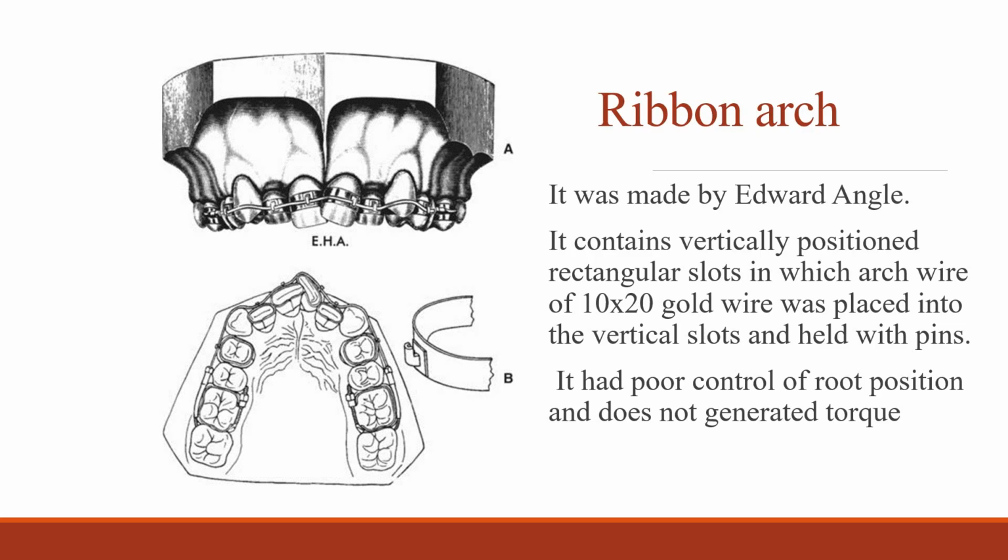The standard edgewise appliance originated from the work of Edward Angle. Everyone now knows who Edward Angle is, the father of orthodontics, who experimented with a series of systems before developing the edgewise slot, on which most fixed appliances are now based. Initially placing the slot vertically, Angle found that by laying it horizontally within the bracket, greater control of the teeth could be obtained. The interaction of a rectangular wire in a rectangular slot provides precise three-dimensional control of tooth position.